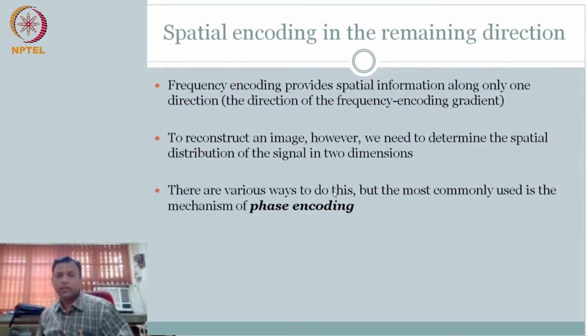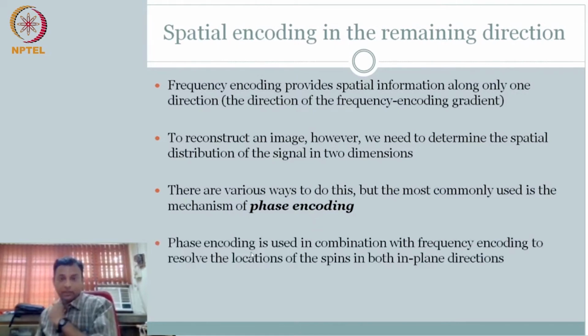There are several ways to do it. One popular way is using what is called phase encoding, frequency and phase. If you have trained your line of thinking for MR using the 2 other encoding schemes and the other concepts that we have looked at, this is straightforward. Essentially, if you can combine this phase encoding with the frequency encoding that we already have, then we should be able to tell the x comma y contribution.